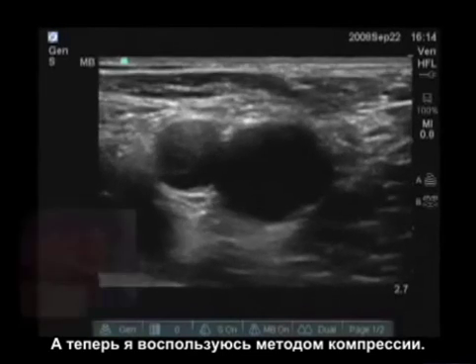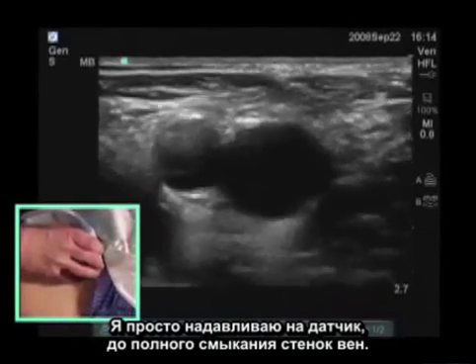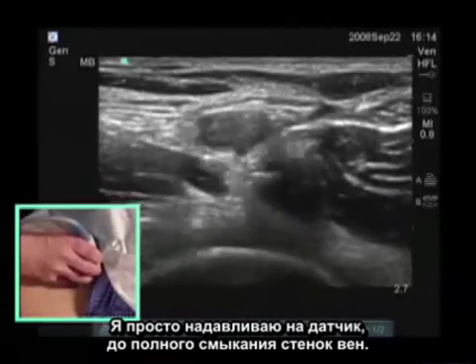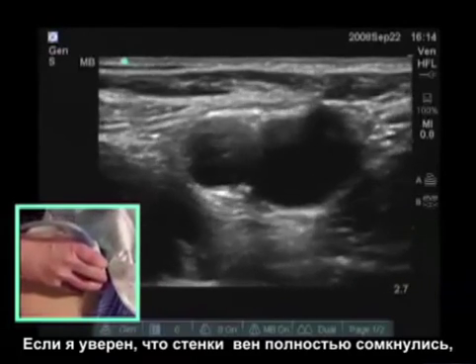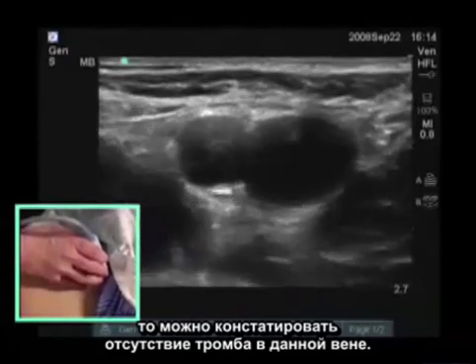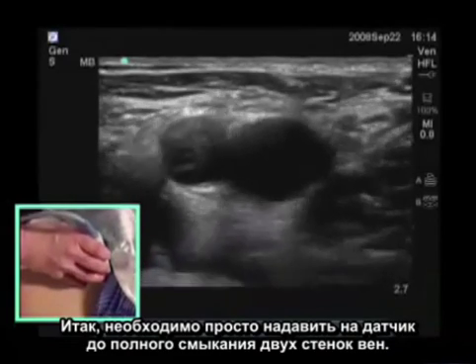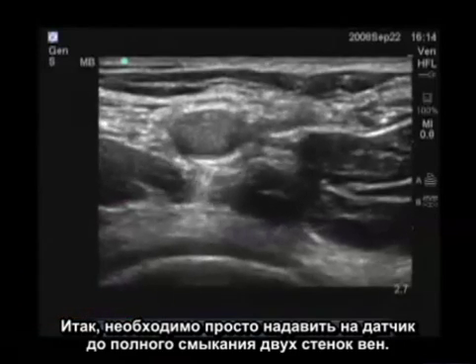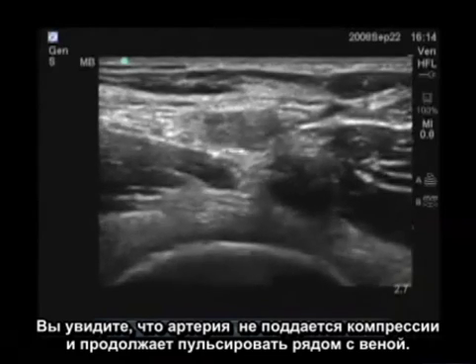At this point, I just use the compression technique — I push with the transducer down until I see both walls of the vein co-opt, or touch and meet each other. If I get a complete co-opt like this, I know there's nothing between those two walls, so there's no venous thrombosis in the vein. Just compress down until you see those two walls meet completely. You'll see that the artery does not compress and is pulsatile beside the vein.